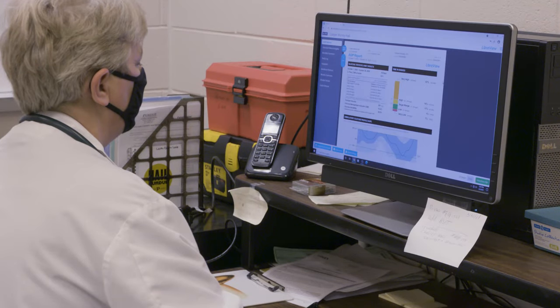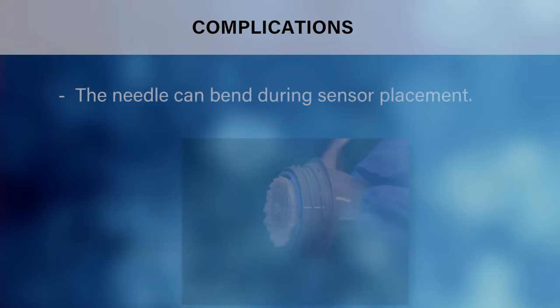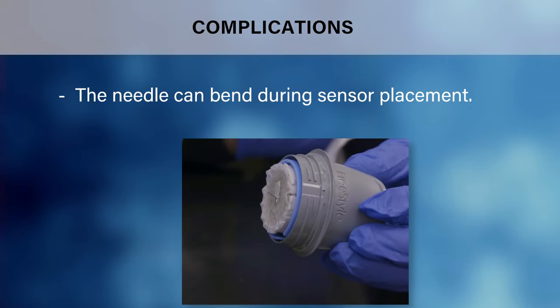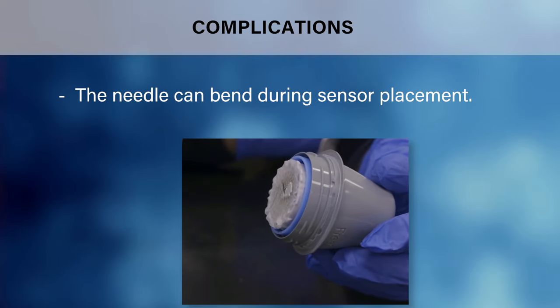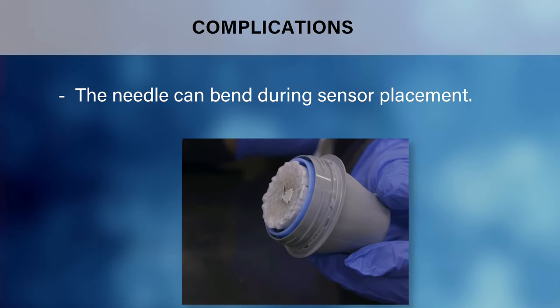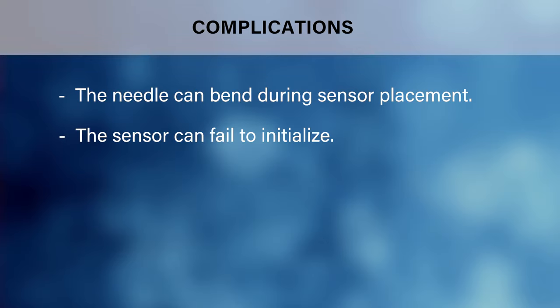Data from the reader can be uploaded to a computer for viewing as a PDF file anytime during the life of the sensor. Complications with both the device and the patient do sometimes occur. The most common problem is that the needle bends during the placement, which can lead to placement failure or difficulty separating the sensor disc from the applicator. Occasionally, the sensor fails to initialize and does not start recording after 60 minutes. I therefore recommend that the patient is not sent home until the first glucose reading has been completed.